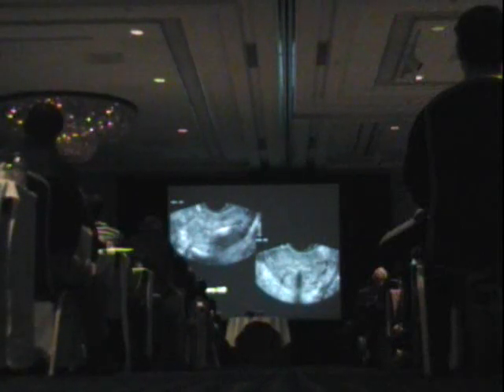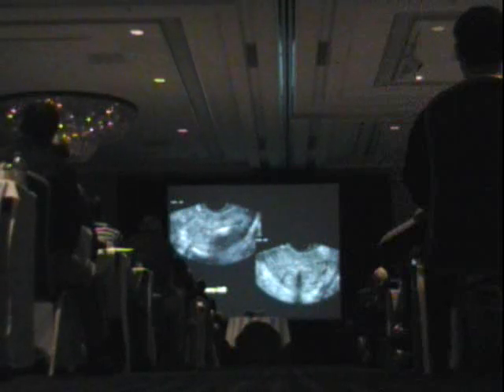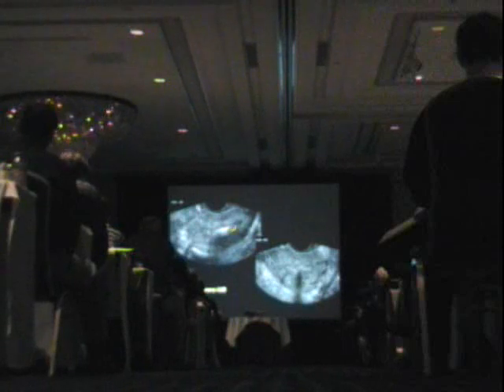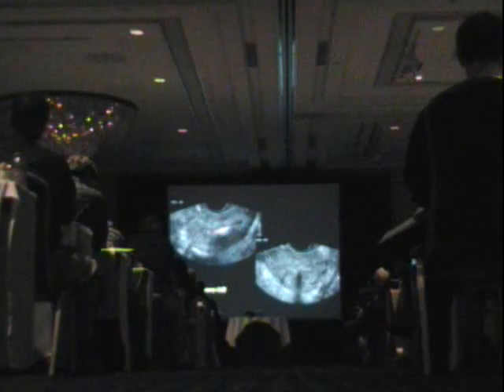But here's the new IUD on the horizon that we're starting to see more and more. This is called the Mirena IUD, and this is an IUD that contains hormones that are released from the IUD. And we have found that this is not as easy to see on ultrasound as the old copper Ts or Lippes loops. What you see with the Mirena IUD is that the lower portion clearly has a dense echo. You don't see the deep shadow from it, but you see this reverberation from the lower portion of it. And that clearly did not come with that patient.